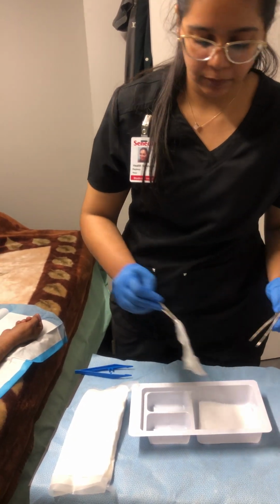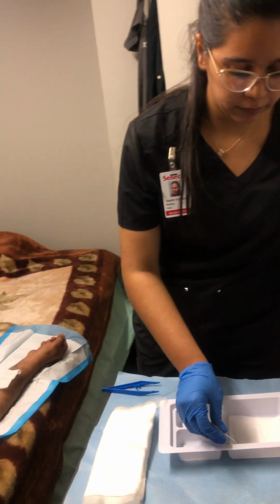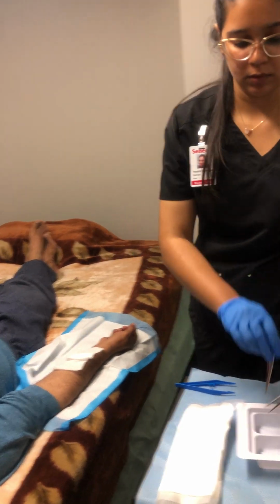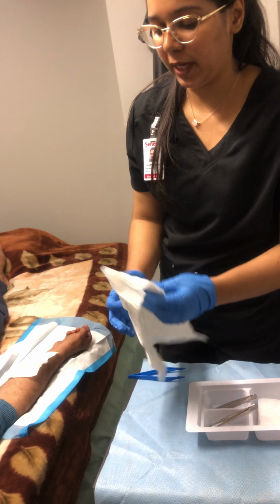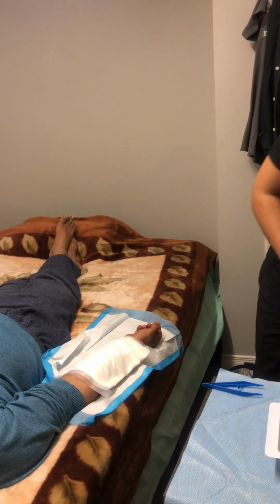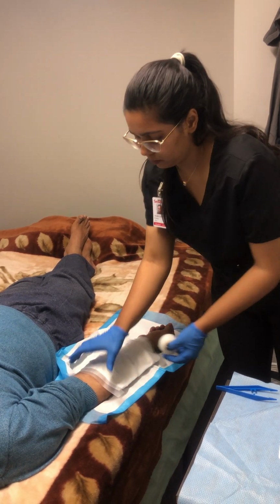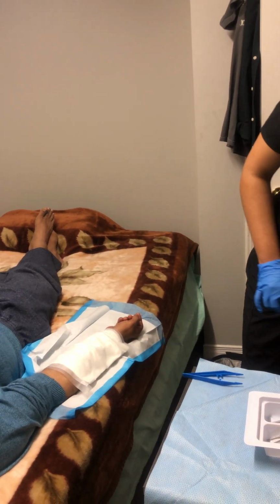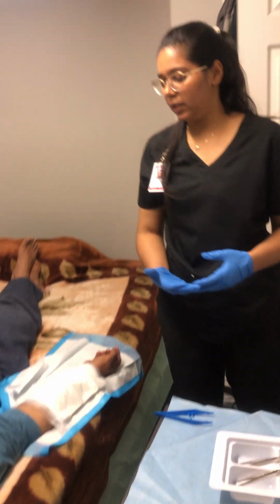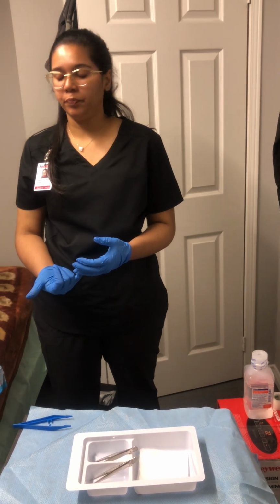Next, I am going to take a 4x4 gauze piece. I am going to place it on the wound. Lastly, I am going to take a sterile dressing. I will place it over the wound. I am going to tape it. And I am going to write the date and time so that the nurse in another shift can know at what time and date the dressing of the patient was changed.